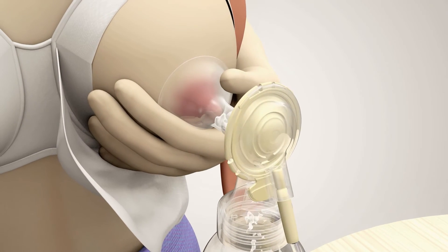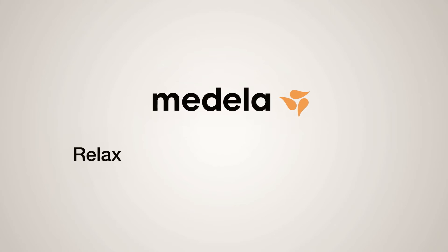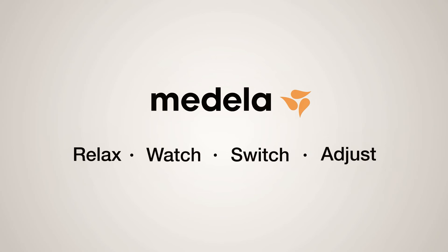So you see, pumping with the Medela two-phase expression technology is easy. Here are some useful tips: relax during the entire pumping session, watch whether the milk starts to flow, switch into the expression phase, and adjust to the most comfortable vacuum level.